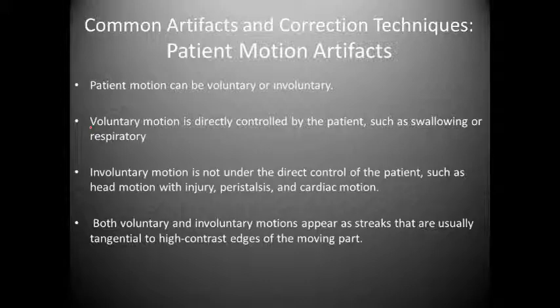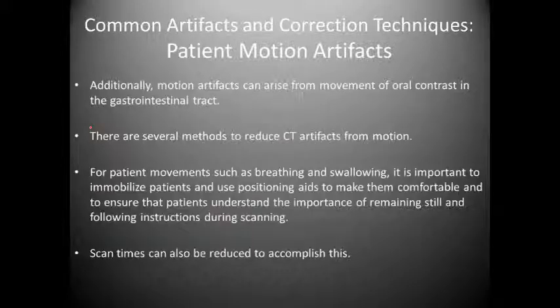Both voluntary and involuntary motions appear as streaks that are usually tangential to the high contrast edges of the moving part. Additionally, motion artifacts can arise from movement of oral contrast agents in the gastrointestinal tract. There are several methods to reduce CT artifacts from motion.